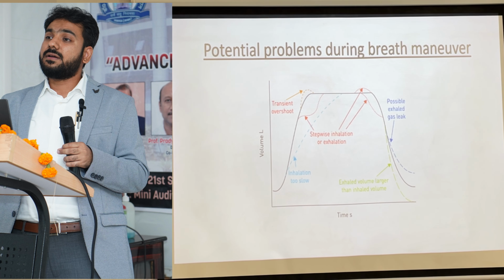So, these can be the potential problems during the breath maneuver, and especially during the breath hold, there should not be any Valsalva or Muller's maneuver. What will it do, the Valsalva maneuver? What is the Valsalva maneuver? This is forced expiration against a closed glottis. So what is it doing? How is it affecting? Anybody?